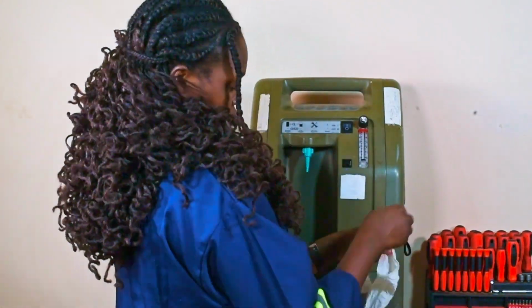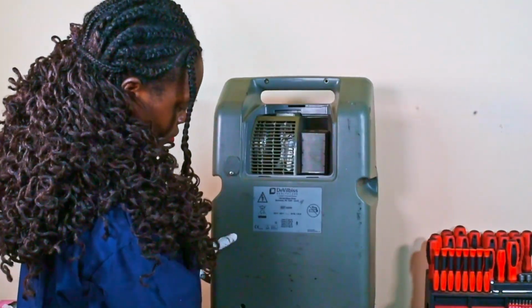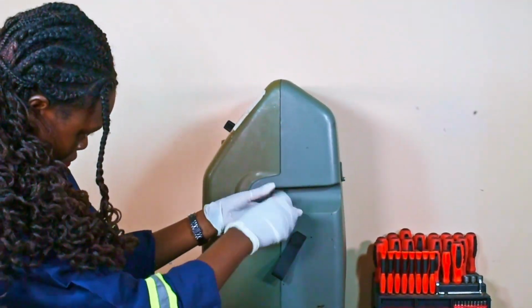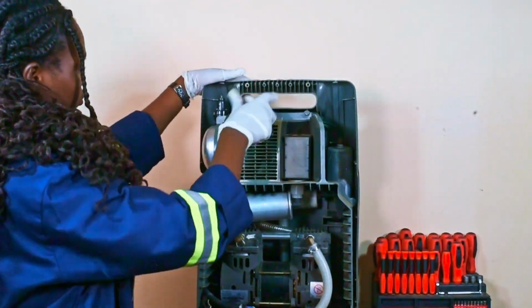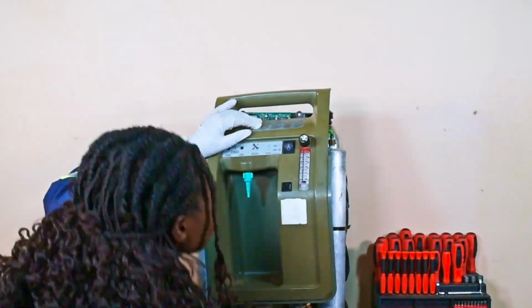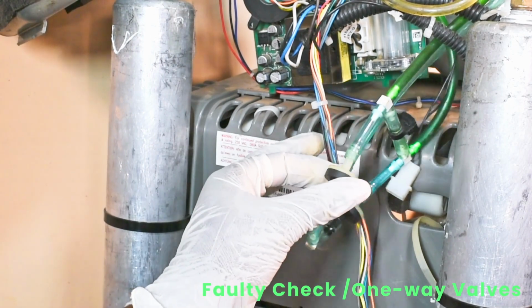Assuming all faults mentioned in our previous episodes have been corrected and the oxygen concentrator is still producing low oxygen purity, you can proceed to check other components of the unit. One of such components is the sieve bed check valves.